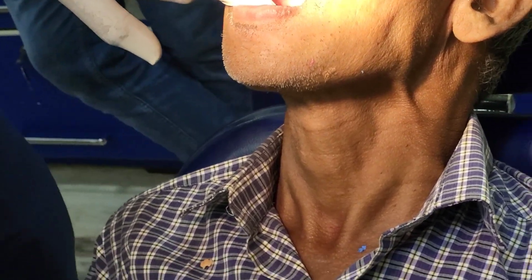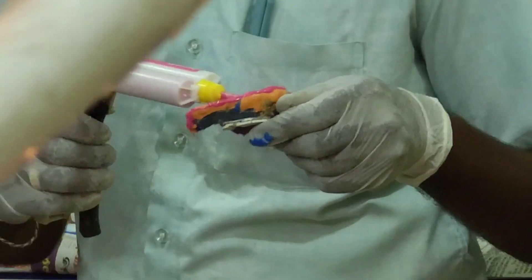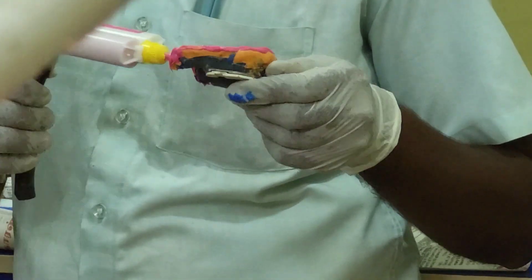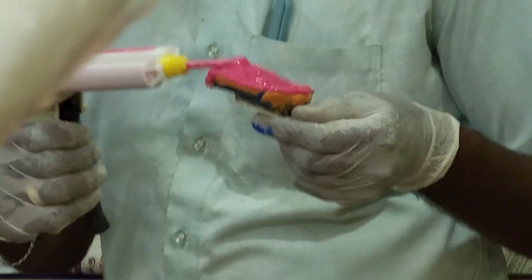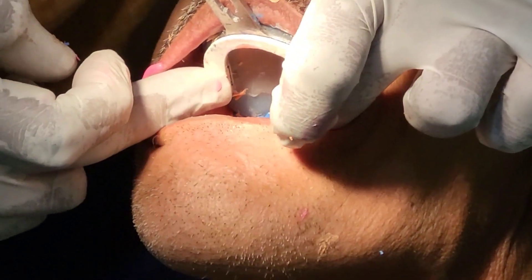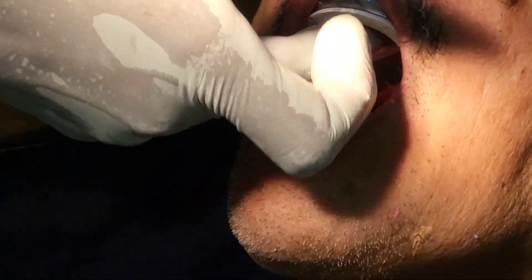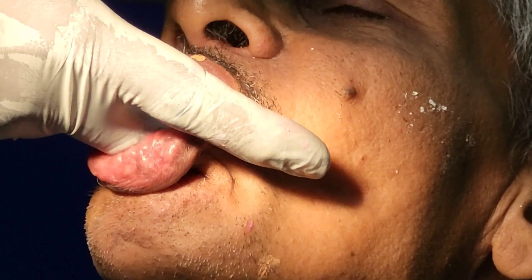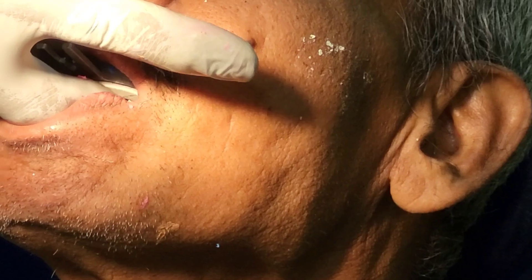The material has set. Now we are going to start applying the extra fine light body on the maxilla also. We are taking the maxillary impression. You can watch the movements needed for maxillary border molding: ask the patient to chew the handle of the special tray and then smile widely, giving these two movements simultaneously twice.